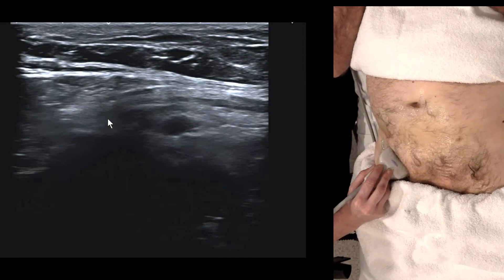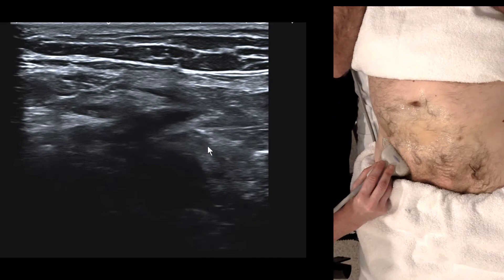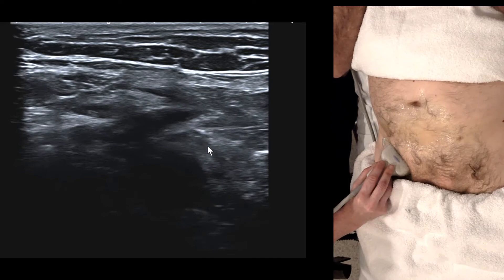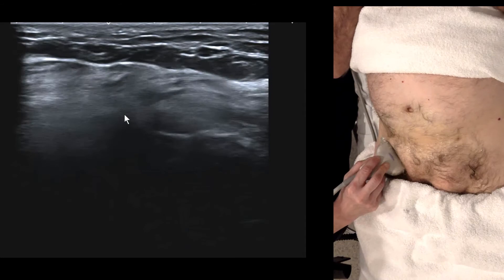We start our strain here - ask the patient to strain and relax again. We can see a defect in the posterior wall. One more look at the deep ring on another big strain - there it is, and on relax nothing is coming through that deep ring, which stays nice and tight.